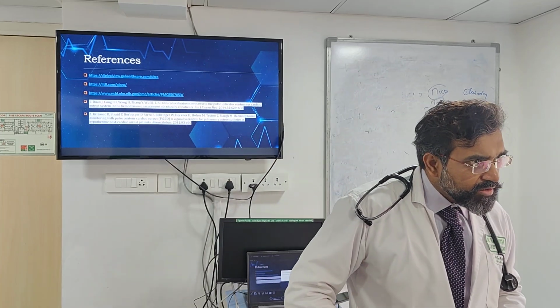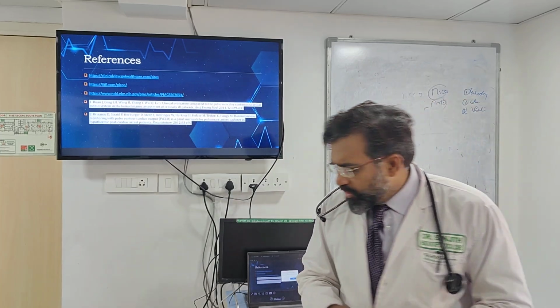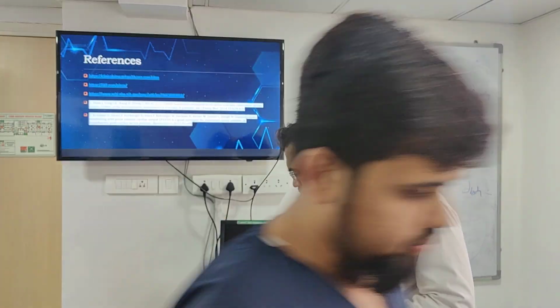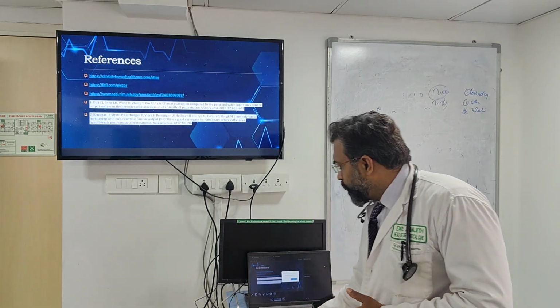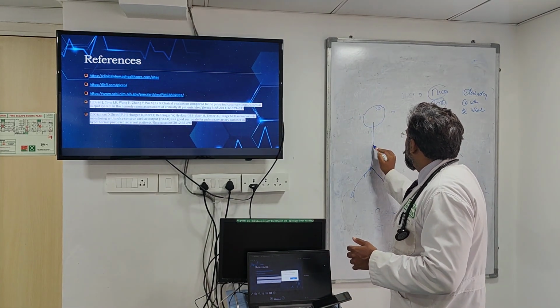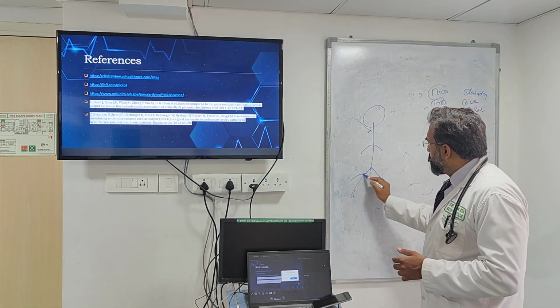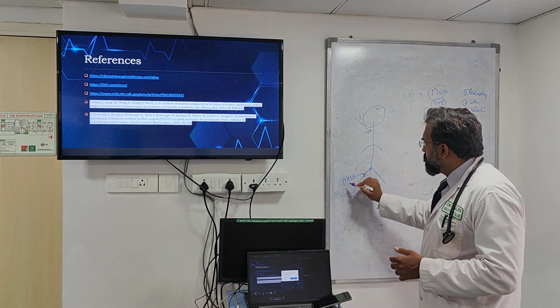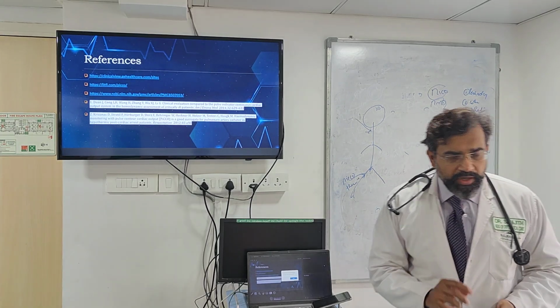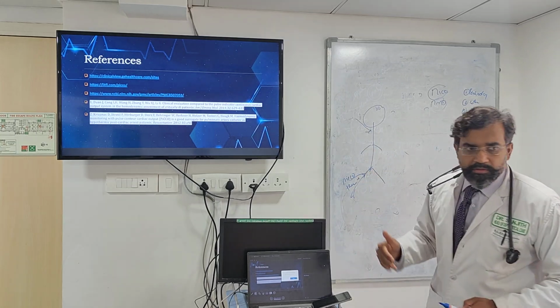Samajh mein aa raha what I'm saying? You are understanding this? So say there are many instances where you put a femoral line. If this is the person, the orientation will remain as here: this will be the central line and here will be my Picco thermodilution thermistor. This is how it is going to be. Simple. Okay. I don't want to have any other device in the middle of this.